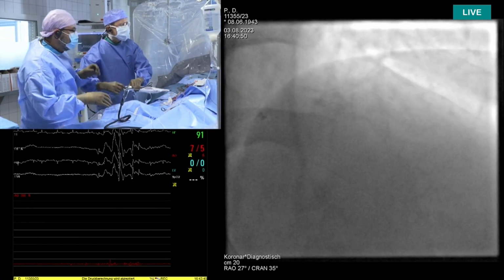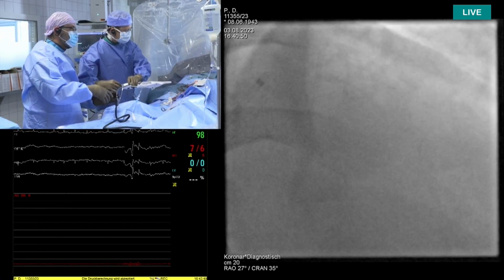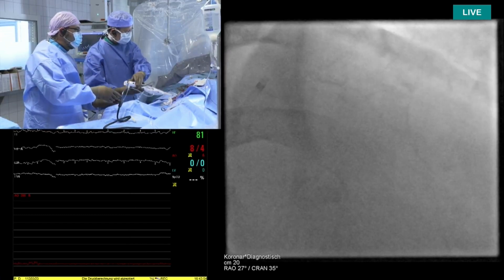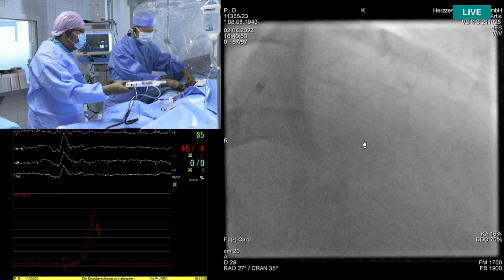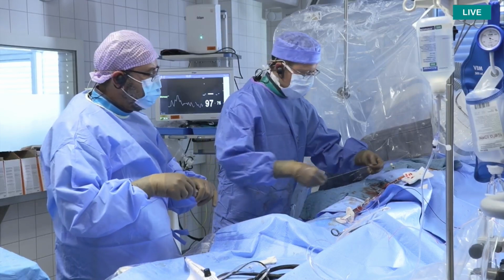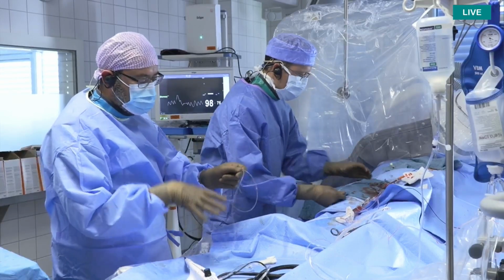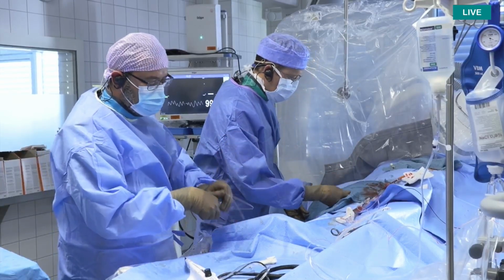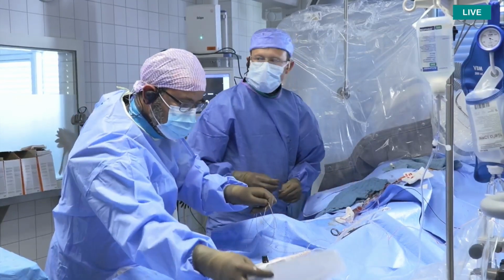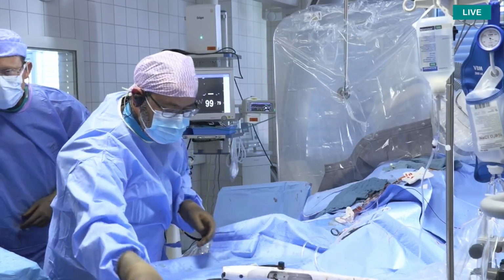I think that's a very good demonstration on how the 1.5 burr was too small for the left main, because you can see that he crossed immediately, so there was basically no resistance. And obviously you predicted that by seeing the discrepancy of sizes between the left main and the LAD. And here you can see that he had a lot more resistance, so showing the real effect of rota. And also a very nice demonstration of single operator rotablation advancing into the catheter, so very fast, very skilled hands.